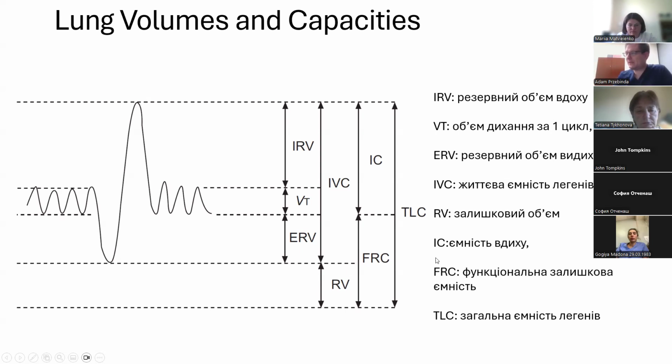This is the RV, which is somewhere here. Oh, sorry, this is the residual volume, RV here, it looks like. The IVC, which was this part, is here, and the residual volume is here. So this is the residual volume. But this is the amount that's left in your lungs after you fully exhale. There's two more concepts, and they become important in a little bit.